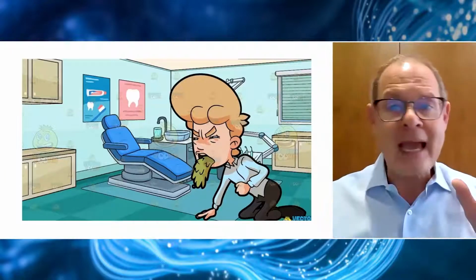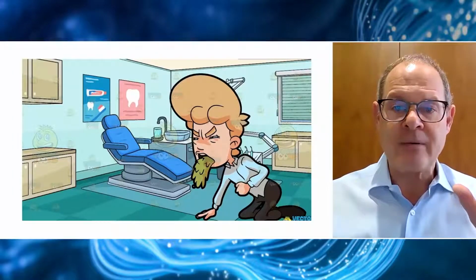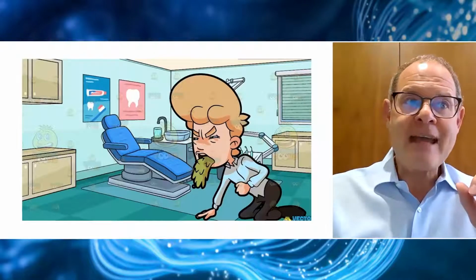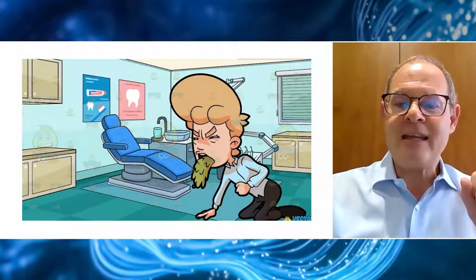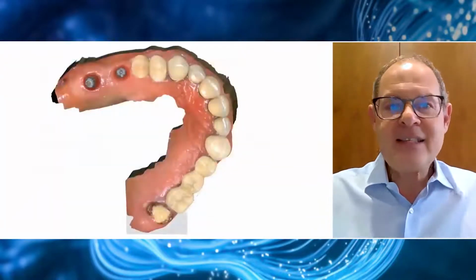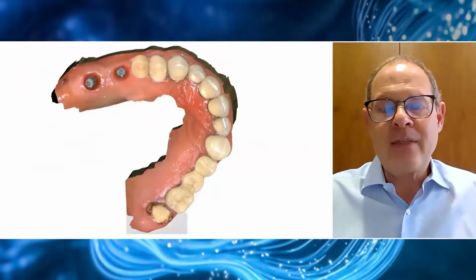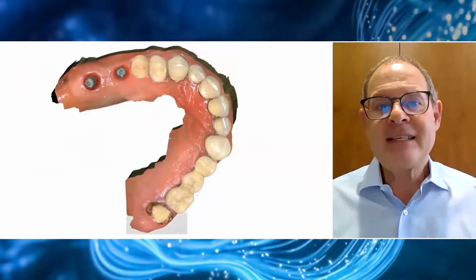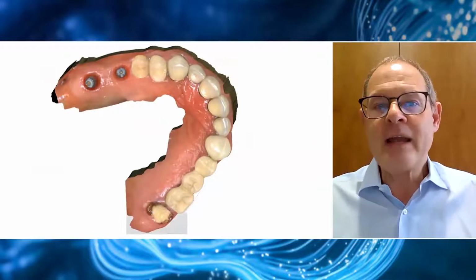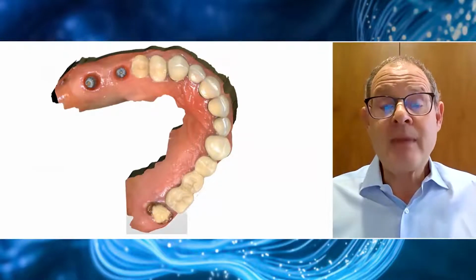So the whole tooth came out, or the whole crown of the tooth came out in the impression. And he was, as you might appreciate, so distressed, as was I, that we agreed that we couldn't do another analog impression. And so this is what persuaded me to at least look into the Primescan. And in fact, this is the very first Primescan impression I ever took. And it's quite impressive, I have to say. It certainly blew me away.